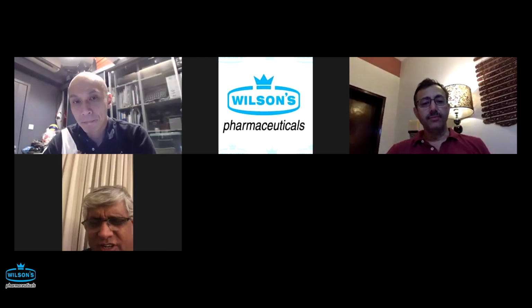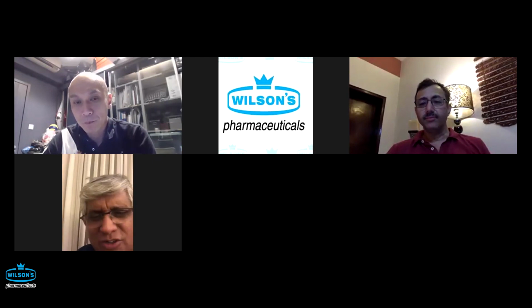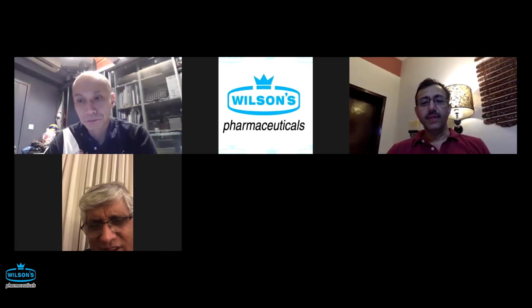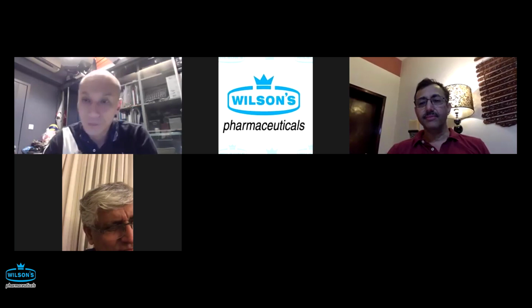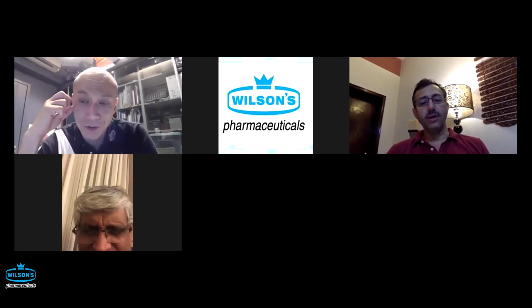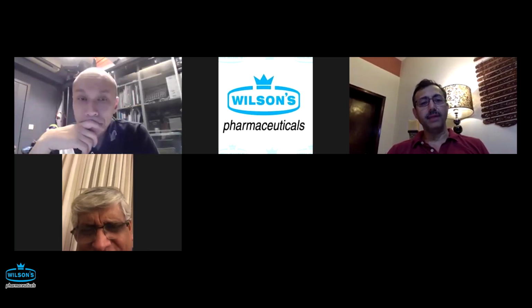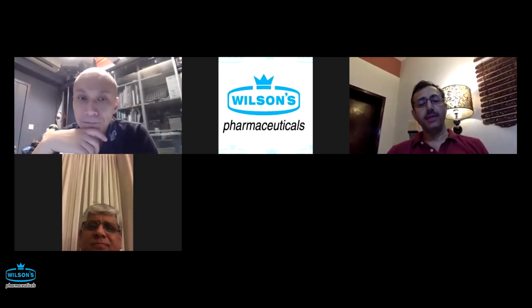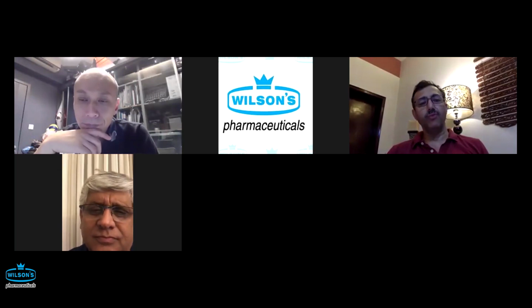There's another question we asked about prevention or prophylaxis of pancreatitis. What size of stents do you prefer? Anthony? I usually use 5 French, 5 centimeter. Would you prefer 3 French or 5 French, single pigtail or straight pancreatic stent, and what size?